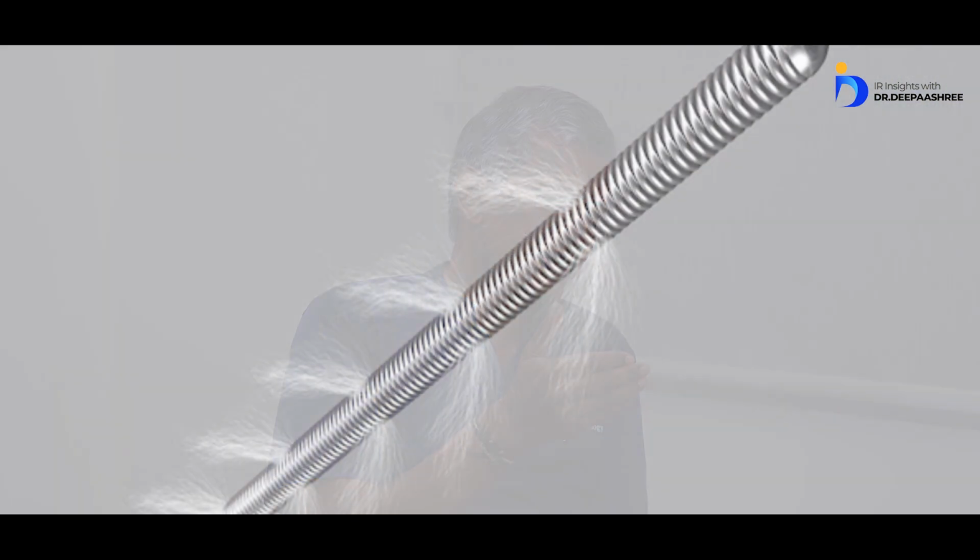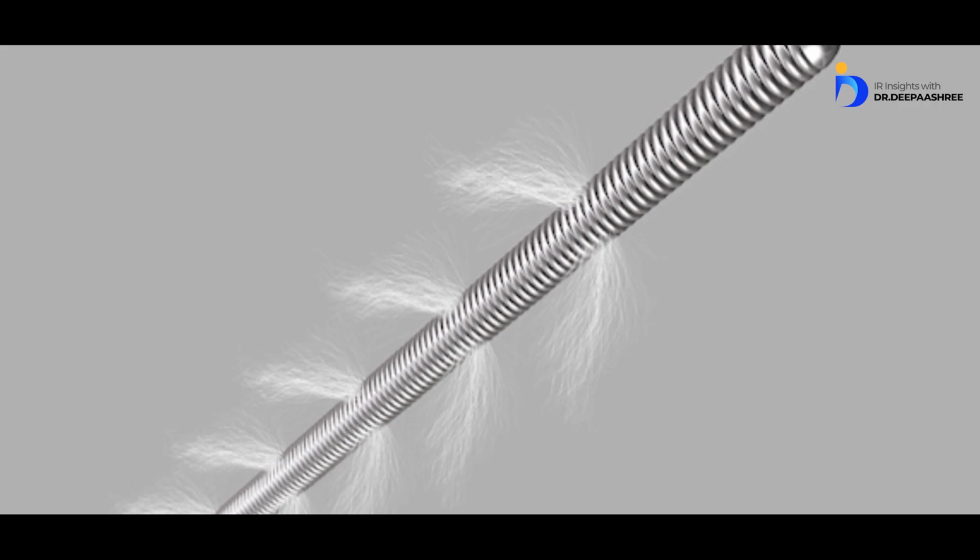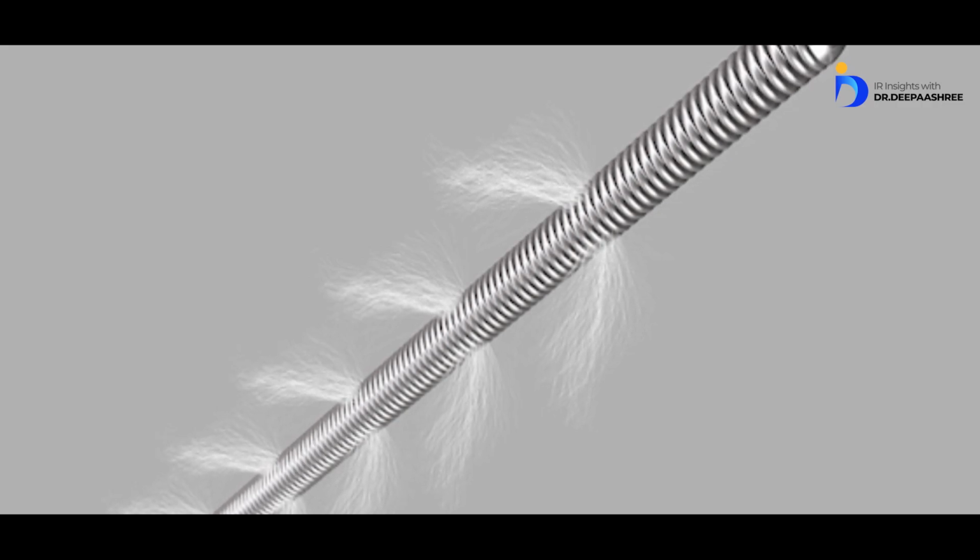It starts at 2 millimeters. I think Boston has introduced a 1 millimeter coil. When we started, it was 2, 3, 4, 6, and then of course 8, 10, 11. Whatever we had, the minimum was 2 millimeter. My favorite coil at that time was the Cook coils. Cook had the Hilal micro coils. But now the Micronester has come, and whatever I was using as a Hilal micro coil, I started using Micronester.